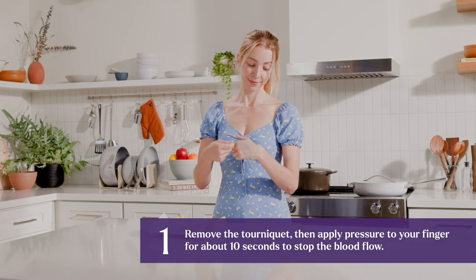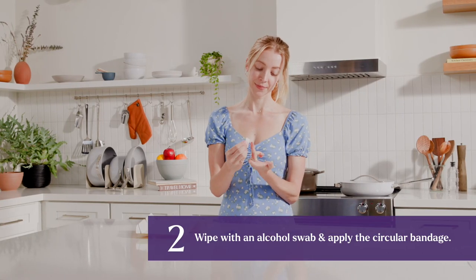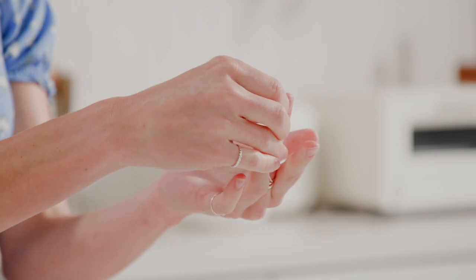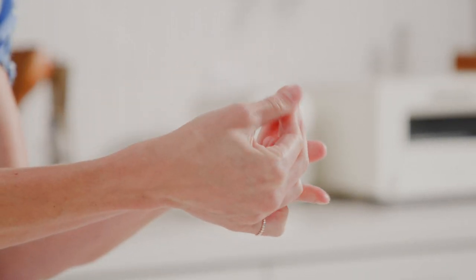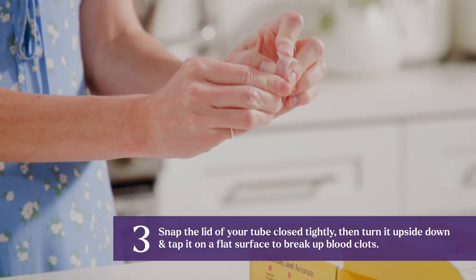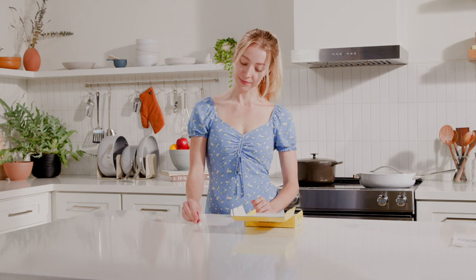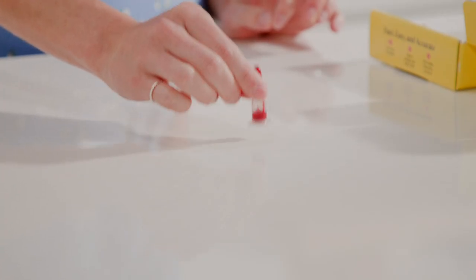Remove the tourniquet and apply pressure to your finger for about ten seconds to stop the blood flow. Wipe with an alcohol swab and apply the circular bandage. Snap the lid of your tube closed tightly, then turn it upside down and tap it on a flat surface to break up blood clots.